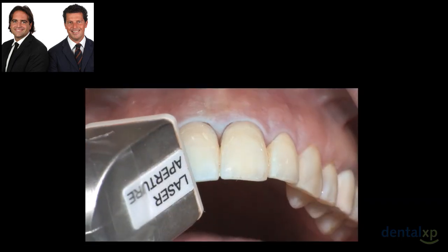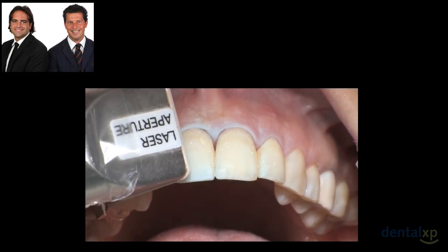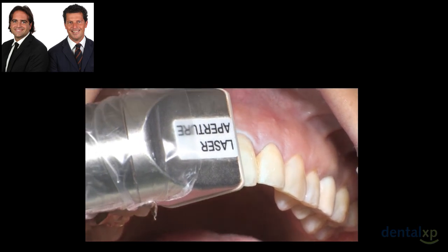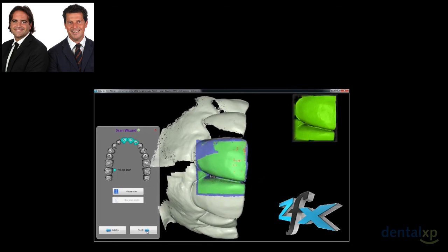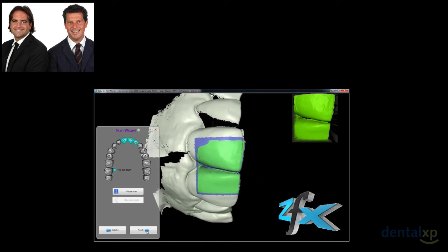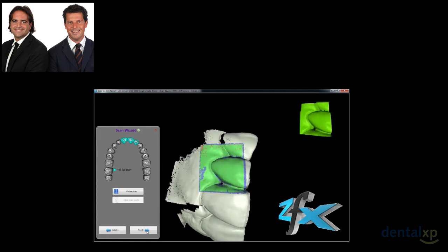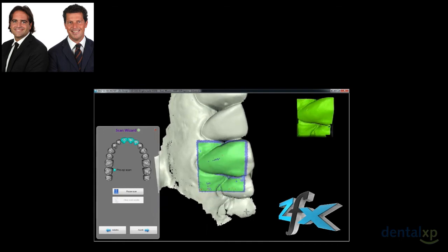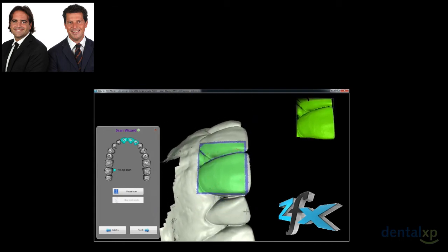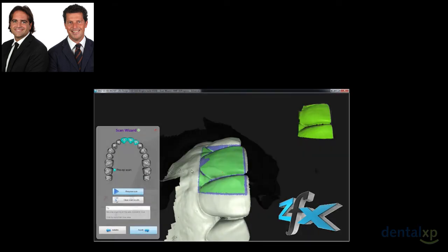And you can see here clinically the slow movements, because of course especially in this moment we have to be very precise, and we don't have to rush. Very slowly move, and you can see here what we are seeing in the computer screen, all the different colors that I was talking about before. You can see here the 3D model generated in the middle of the screen, and on the top we have the green area that is telling us that we are doing good.